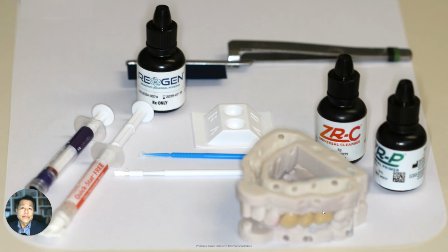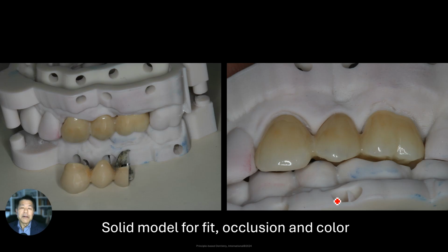This is the setup. On the left-hand side, I've got my phosphoric acid etchant. It's Velvet Etch, 40% phosphoric acid. Then I've got my Quick Stat Free, which by now you probably all know I love. It's my hemostatic agent of choice, whether I'm dealing with the tooth in front of the mouth or in the back. I've got my Regen, my bioactive adhesive. I've got my ZRC and my ZRP. Now, the ZRC and the ZRP are two things you absolutely have to have when you're bonding zirconia. And I have it all the time.